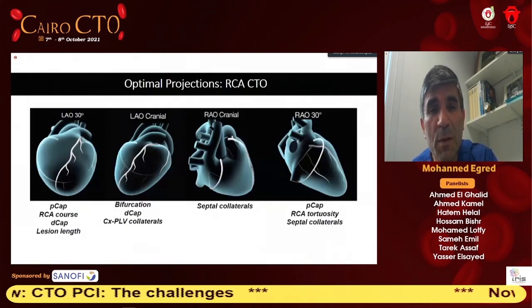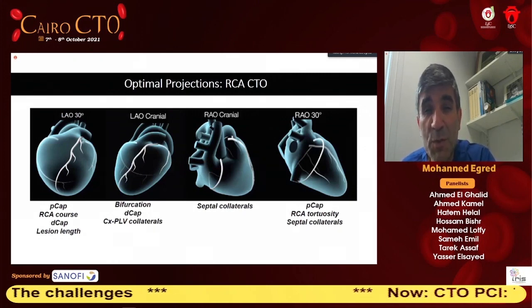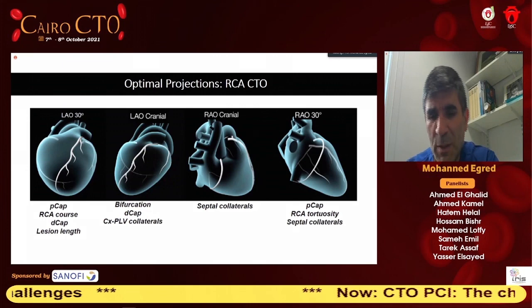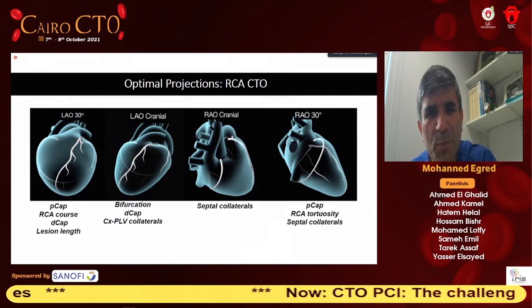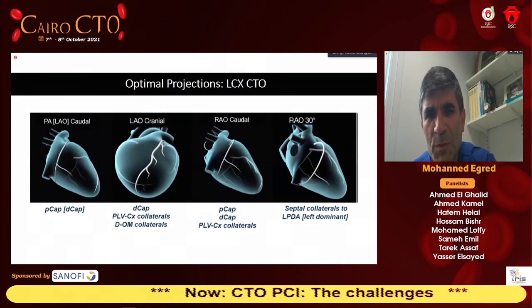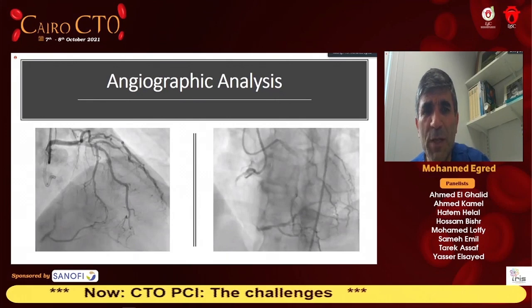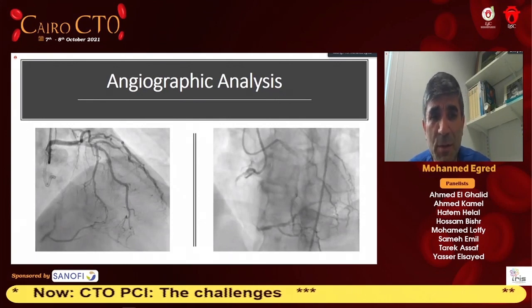Of course, in order to do a good angiogram, you need to choose the optimal projection. I'm not going to go through this because all of you are experienced and you know which one to see the right, which one to see the LAD, and which one to look at the circumflex. And for the angiographic analysis, once you've seen that, here we go.